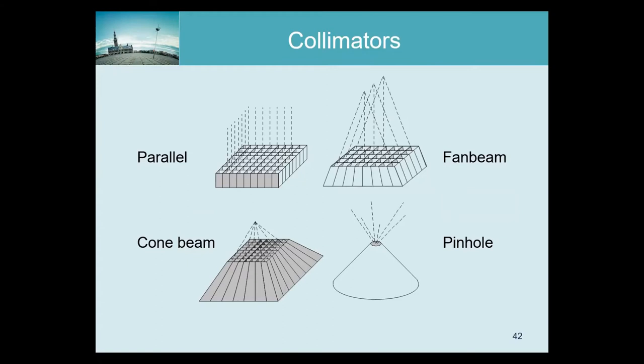So if you have to make collimators, you can just as well try to turn it into an art and have a bit of fun with it. So the most popular collimator is the parallel hole collimator. There are several reasons for that. First, manufacturing parallel hole collimators is difficult, but it's easier than manufacturing most of the other ones.